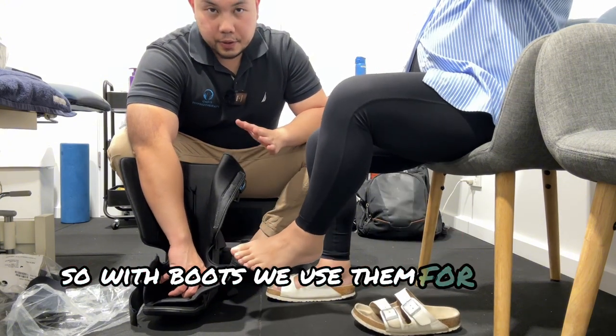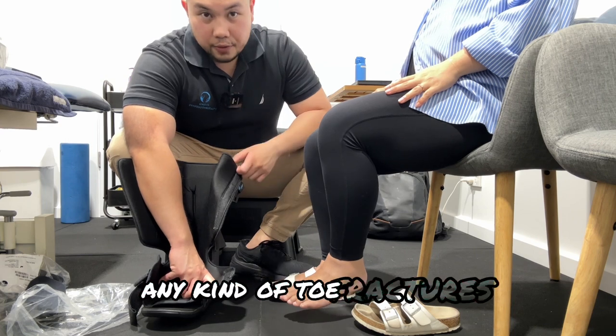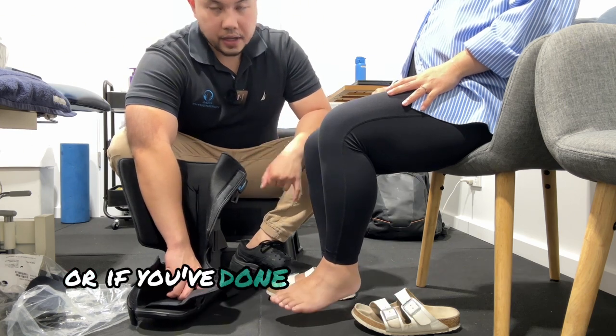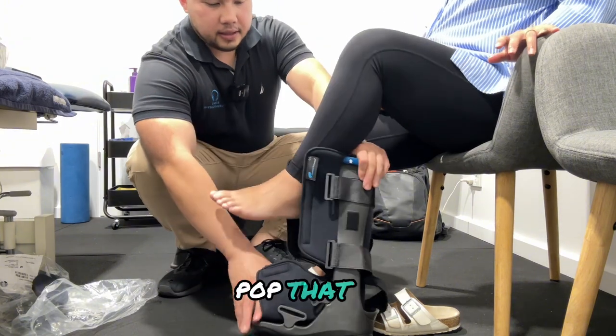With boots, we use them for ankle injuries, ankle fractures, any kind of toe fractures — anything where it's been recommended by a doctor or a surgeon that they don't want to put pressure on it, or if you've done a really bad ankle sprain.